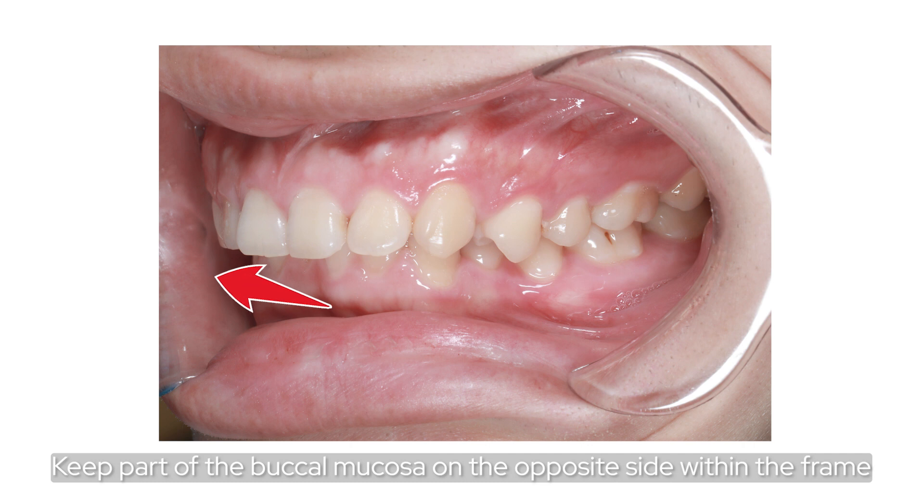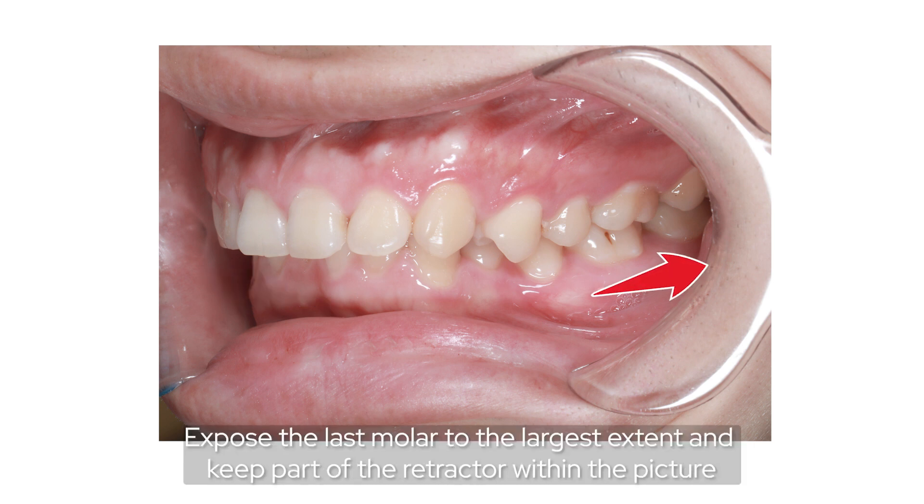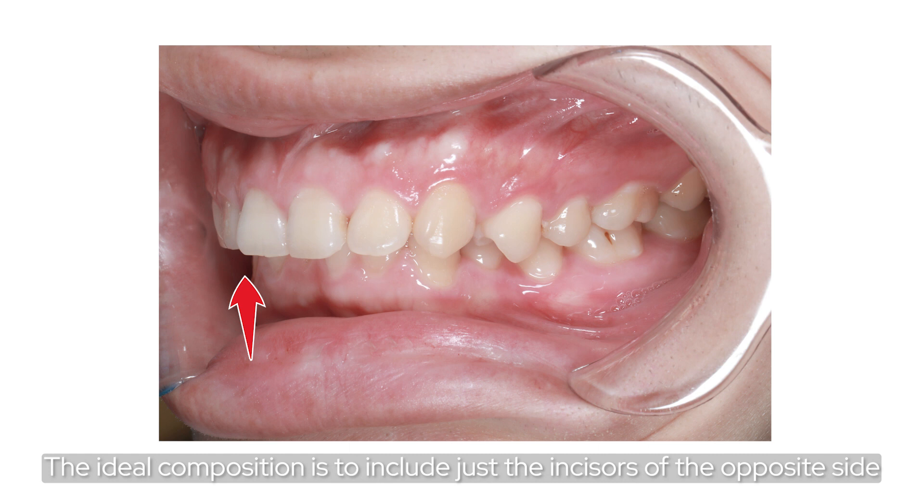Keep part of the buccal mucosa on the opposite side within the frame. Expose the last molar to the largest extent and keep part of the retractor within the picture. The ideal composition is to include just the incisor of the opposite side.